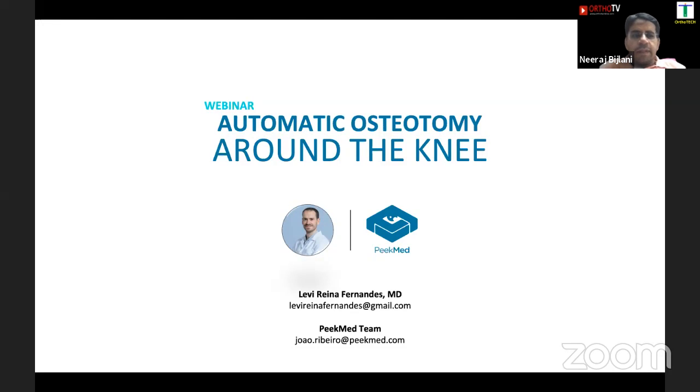Today we have with us Dr. Levi Reina Fernandes, all the way from Portugal. His main specialty is deformity correction, and he's going to be talking to us on how he uses the Peekmed software and he's going to demonstrate automatic osteotomy around the knee. On the panel, we also have with us Dr. Mangal Parihar and Dr. Vaibhav Bagaria from Mumbai, India. So over to Dr. Levi Reina Fernandes.